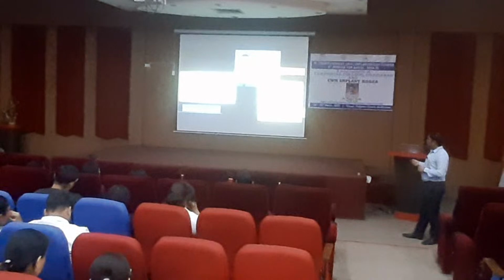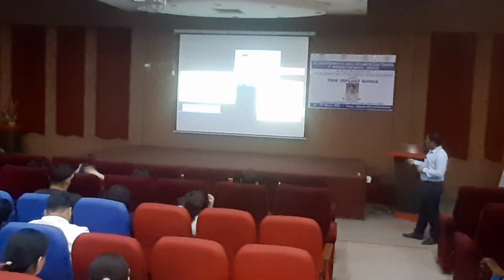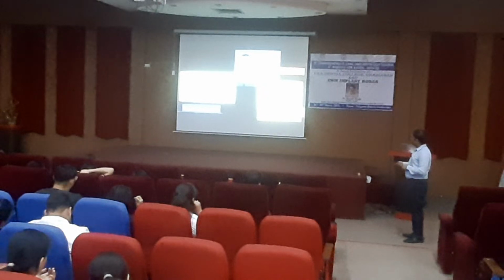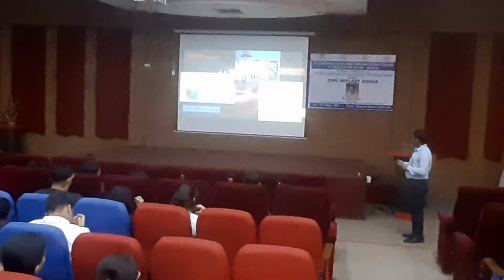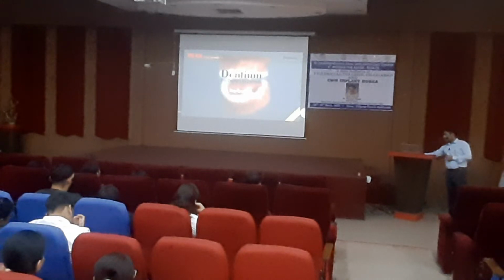These are the initial ones, the ridge expanders. These are the mallet, various expanders, motorized expander, the wheel. This is for the crestal cut. This wheel is for the crestal cut. Ratchet for screwing it, for the threading. This is the mallet we are using for separation. This is the older one. This is the RS kit by Dentium. Nowadays, nobody uses it.